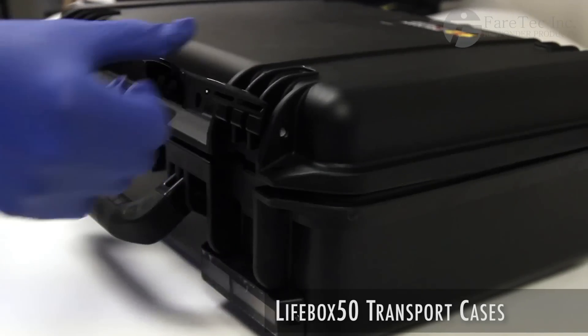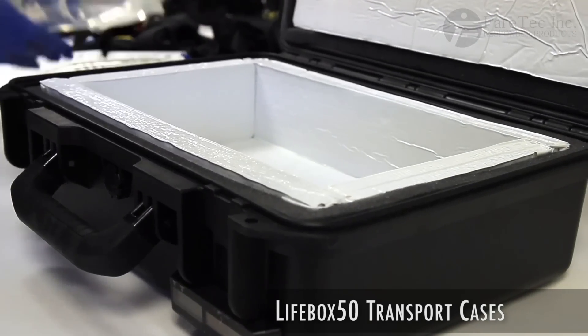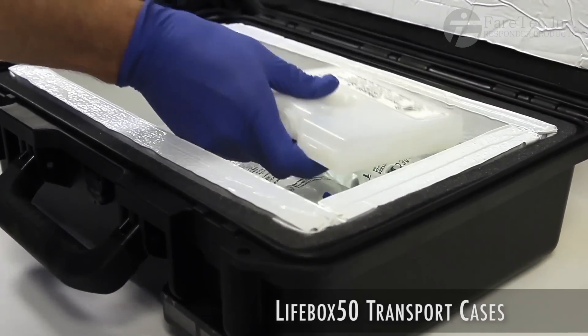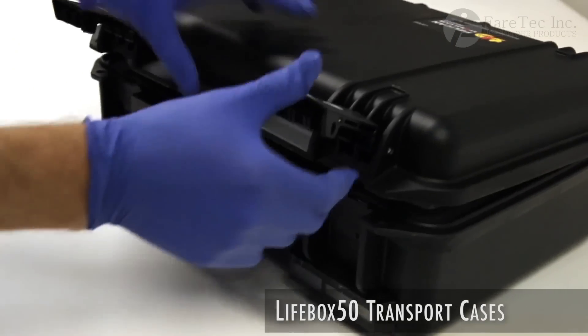The Lifebox 50 utilizes small solid cooling panels which are simply inserted into the box along with the supplies. These are known as phase change materials and have been designed to keep items cold but not frozen.